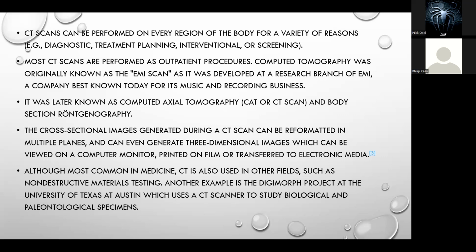Most of the time it's performed as an OPD procedure, just like all the other scans. At a point in time, it was called EMI scan because it was developed in a company called EMI, that developed it for another purpose, but we have adopted it.